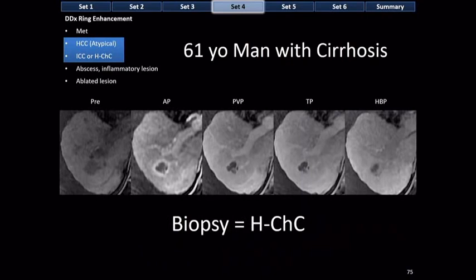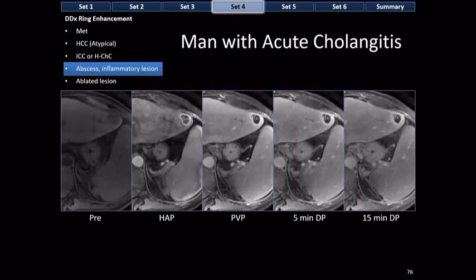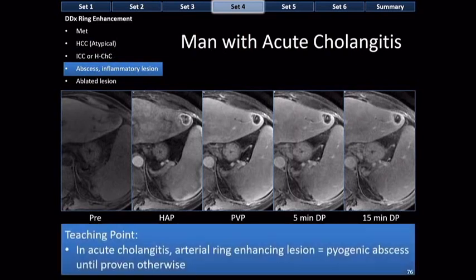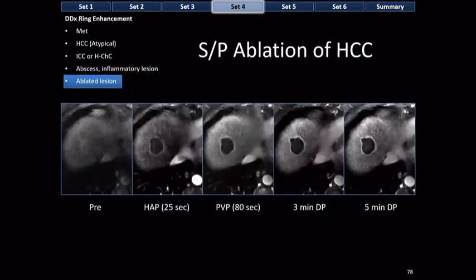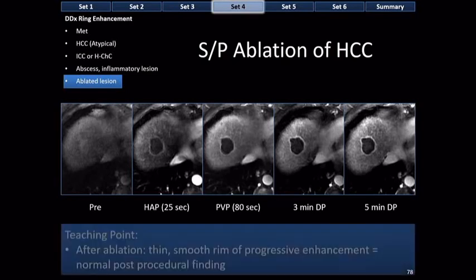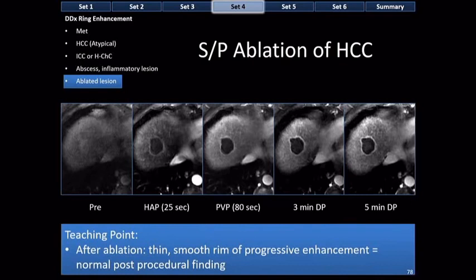The same ring-enhancing appearance in the setting of acute cholangitis — same lesion — is an abscess. In the setting of previous ablation, if the rim progressively enhances from faint arterial phase enhancement to progressively more enhancement on delayed images, that's normal post-ablation change — granulation tissue surrounding an ablation cavity. Teaching point after ablation: a thin smooth rim of progressive enhancement is a normal post-procedural finding.